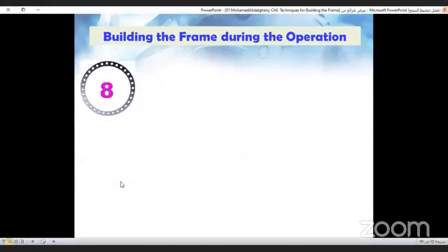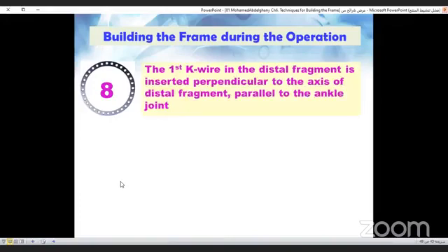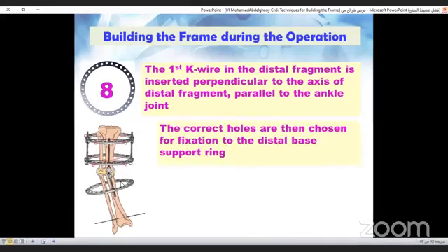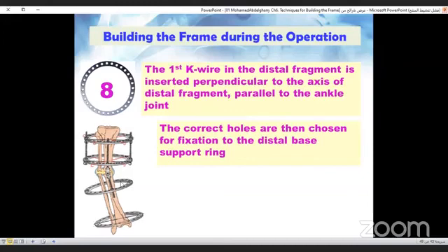In step eight, insert the first key wire in the distal fragment perpendicular to the axis of distal fragment parallel to the ankle joint. Then fix the distal base support ring with the key wires.